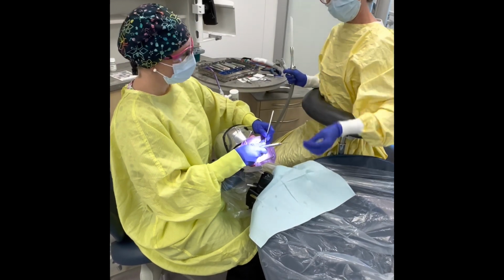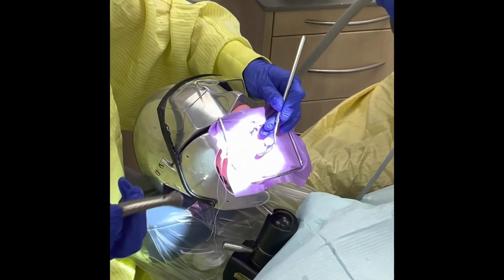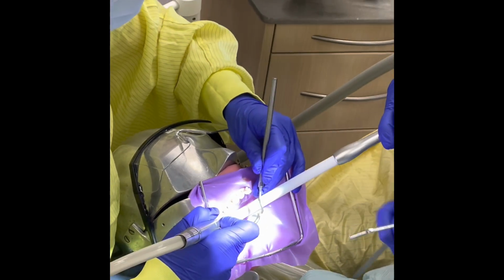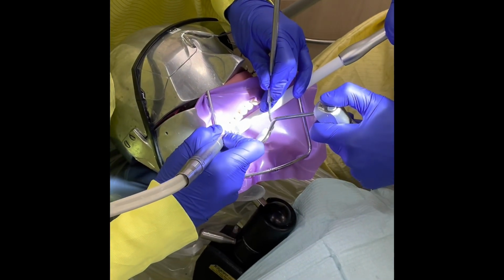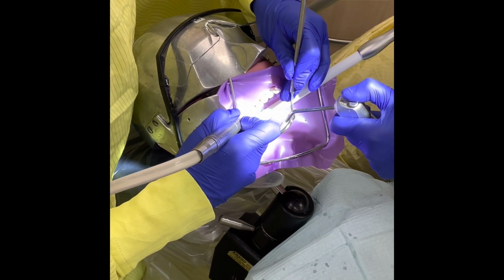We'll move on to the posterior. Okay, so high-speed hand piece again. You're going to come in, place your suction, and ensure that there's no water on the mirror for the operator.